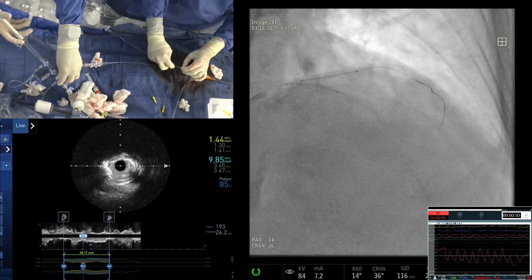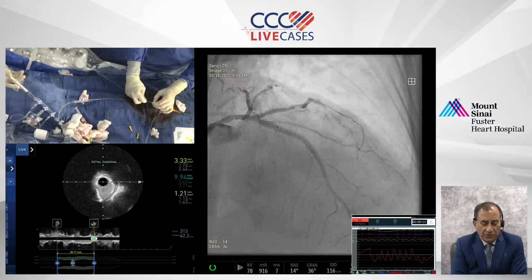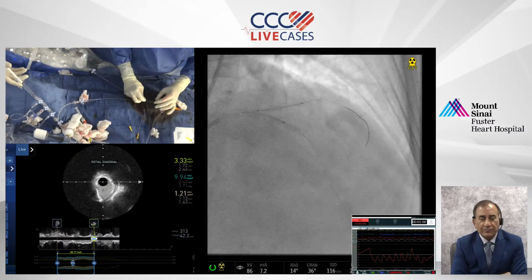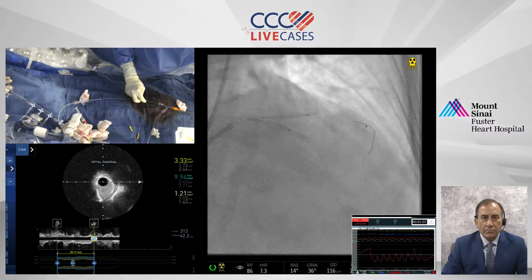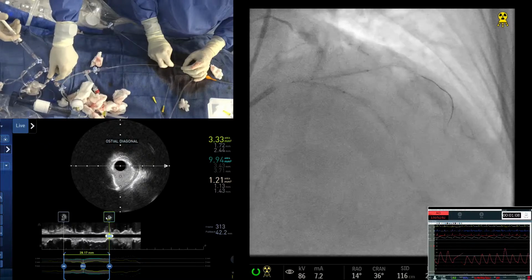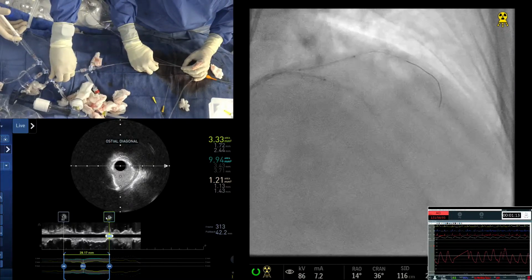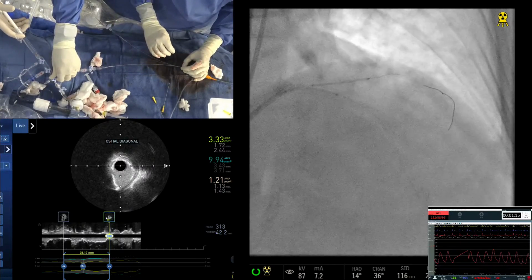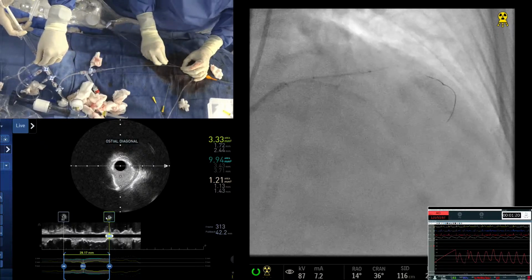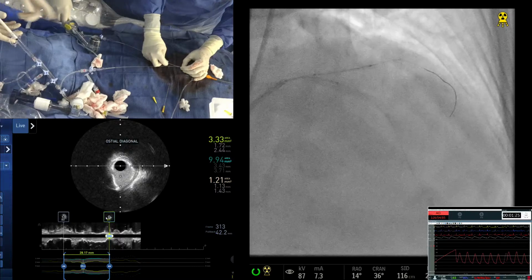Ready? Anu, I am so glad you decided on this because this is the real difference which will be in the case. And the question is, the main vessel you want to do longer? Hold on. Now some dye there. Now we have 23. I can pull back because this is a little too much overlap. Okay, now some dye. Here we go. This is the definitive step of the case. Okay, good. So which is the diagonal first? Yeah, that's the diag.